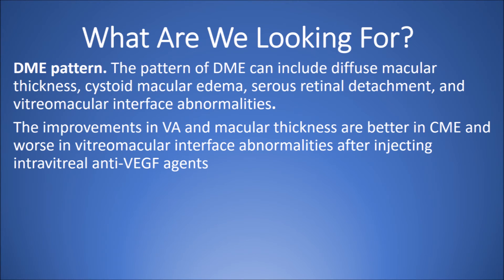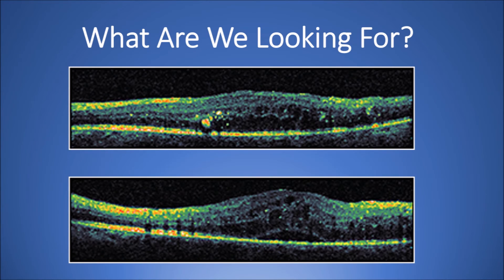OCT can tell us about the diabetic macular edema pattern, which can be presented as diffuse macular thickening, cystoid macular edema, serous retinal detachment, and vitreo-macular interface abnormalities. The improvement in vision and macular thickness is better in cystoid macular edema and worse in vitreo-macular interface abnormalities after injecting intravitreal anti-VEGF agents. The upper image shows cross-sectional OCT with diffuse macular thickening, while the second image shows serous retinal detachment with some intraretinal cysts.